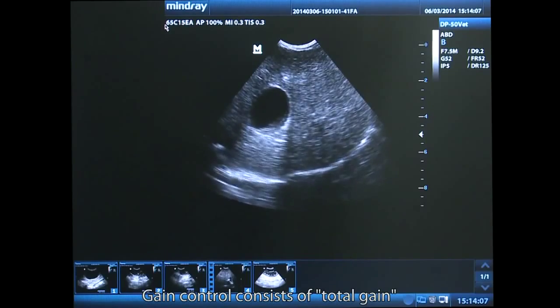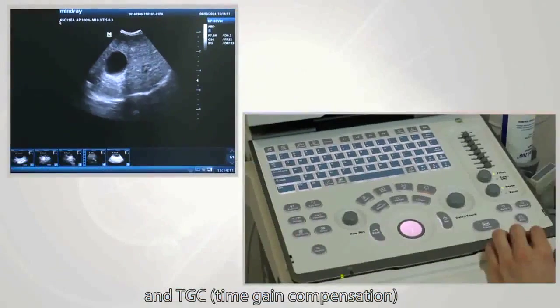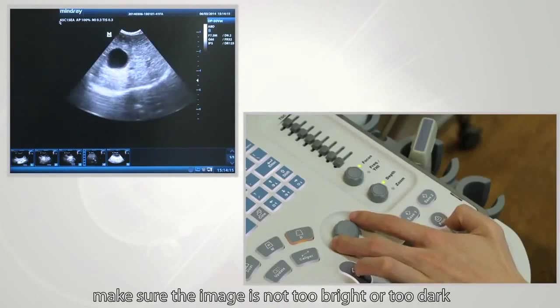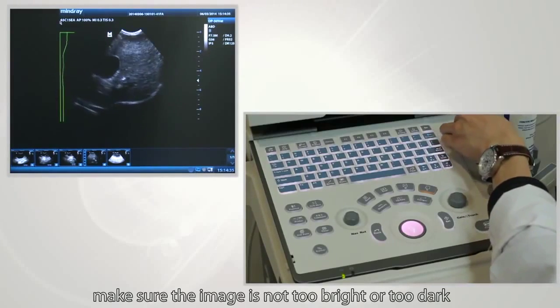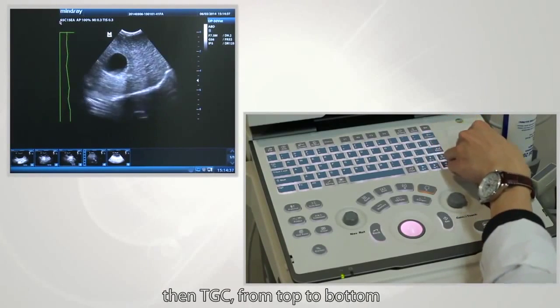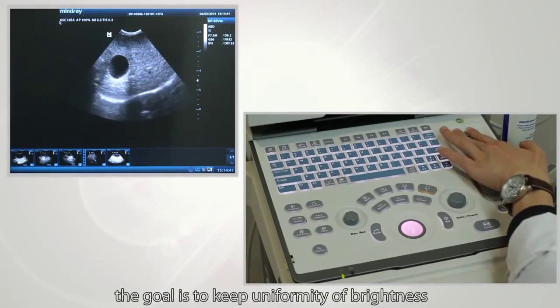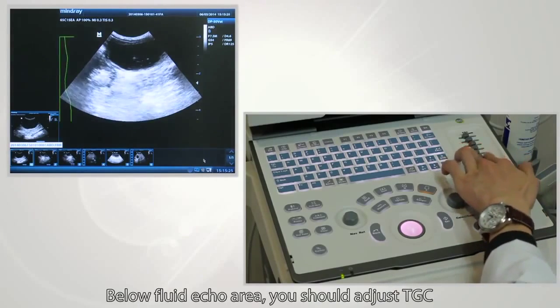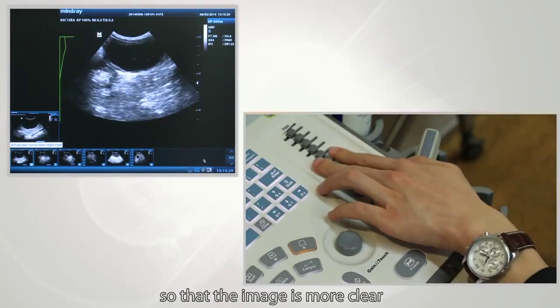Gain control consists of total gain and TGC, which means time gain compensation. First, adjust total gain — make sure the image is not too bright or too dark. Then adjust TGC from top to bottom; the goal is to keep uniformity of brightness. Below a fluid echo area, adjust TGC to a relatively lower level so that the image is clearer.